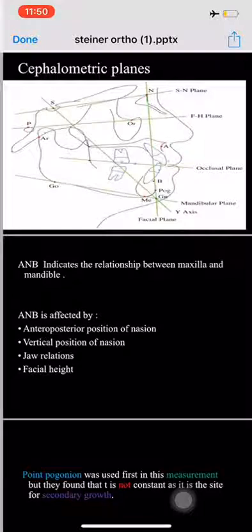Vertical position of the nasion, anterior posterior of the nasion, also, and vertical position of the nasion. Jaw relation, jaw relation and the facial height, especially lower facial height.